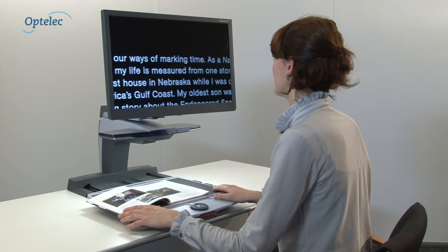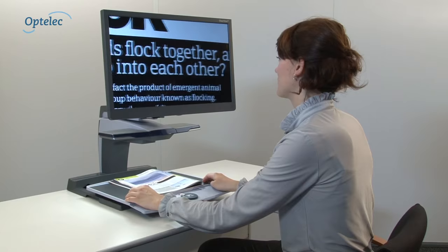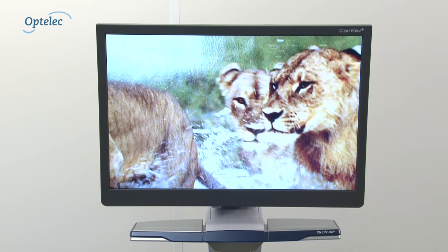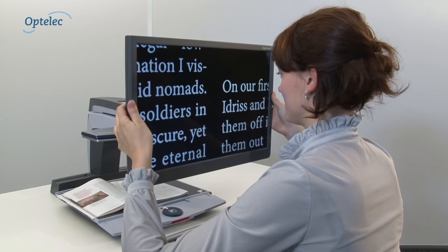Optelec Clearview Plus monitors are superior. Contrast and brightness settings are optimised for use by visually impaired people to make the visibility of characters and words and the display of images clearer. The screens are free of buttons and are available in different sizes. For your comfort, you can adjust the position of your Optelec Clearview Plus screen.